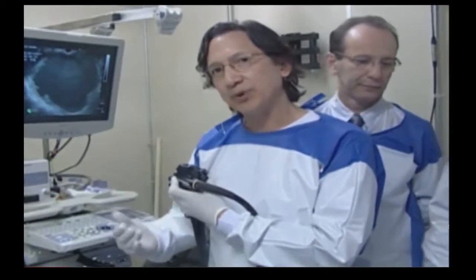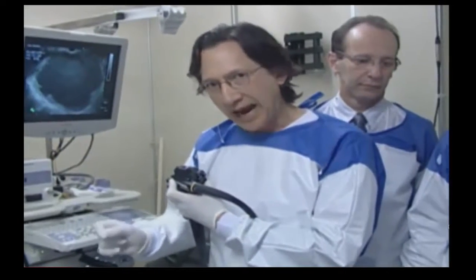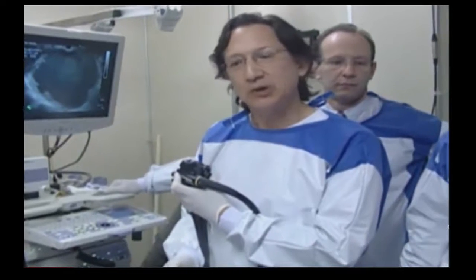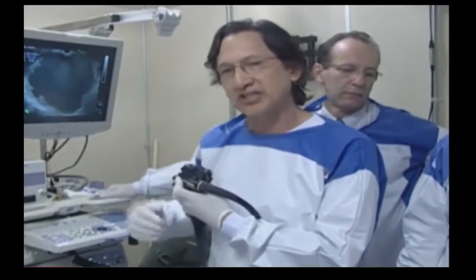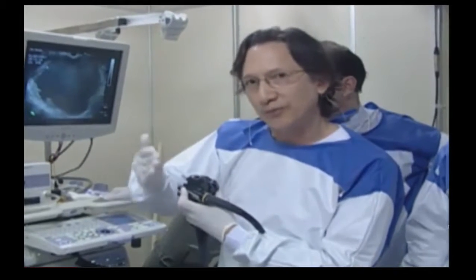And then the next step would be to pass the guide wire into the cyst. Then you need to dilate the tract, and you can dilate the tract with cautery. You can use a cystotome to do that, or you can use a balloon. So typically in the United States, we don't have the smaller cystotome, only the 10 French, so we will usually go to balloon dilation over the wire next. But sometimes that's difficult because of the step off between the wire and the balloon, and that's why that middle step, cystotome first, then balloon dilation, is often performed.